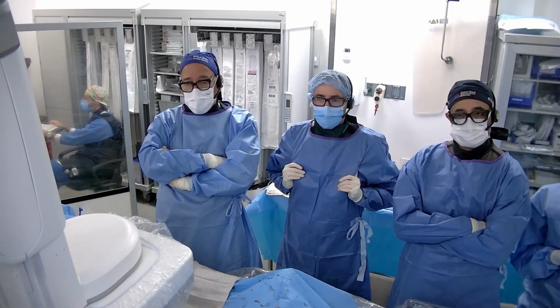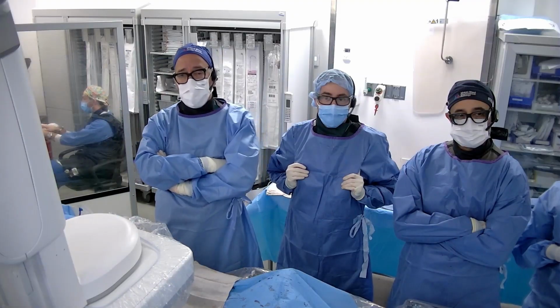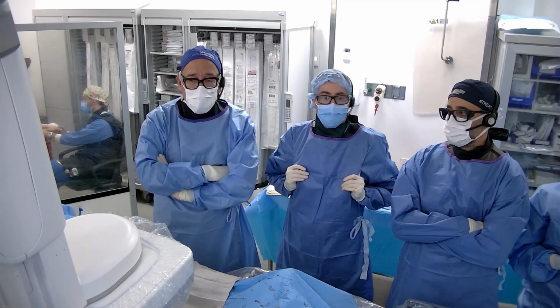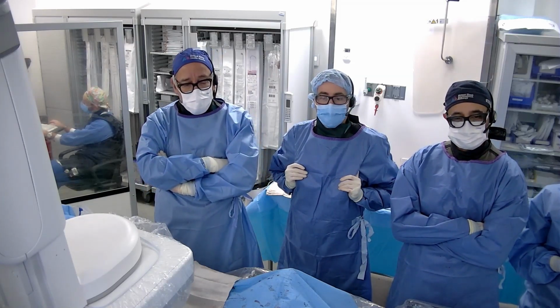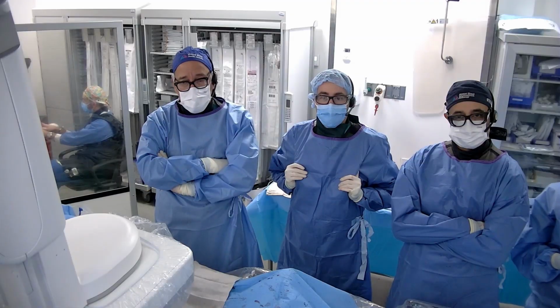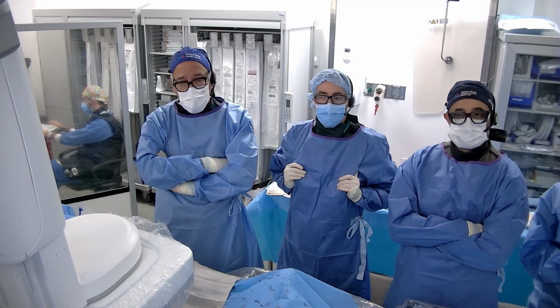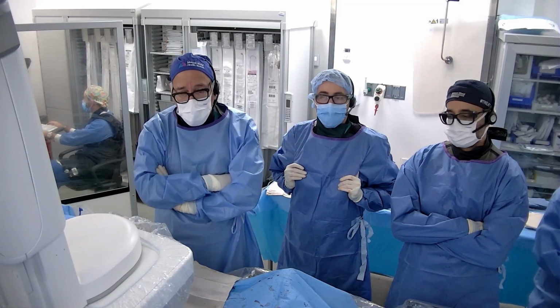Looking at the IVUS, it's mostly that soft fibrotic plaque. There's a little bit of calcium there too, but I think put an embo shield down and I would laser this all day long. I agree with Jay. I think it's really soft, certainly in the SFA, calcified in the popliteal. So it's probably fairly intraluminal. It didn't seem to be very eccentric with that wire placement. So I'd be attracted to directional atherectomy as well with a filter. Maybe IVL on that popliteal. I'd be tempted for that.